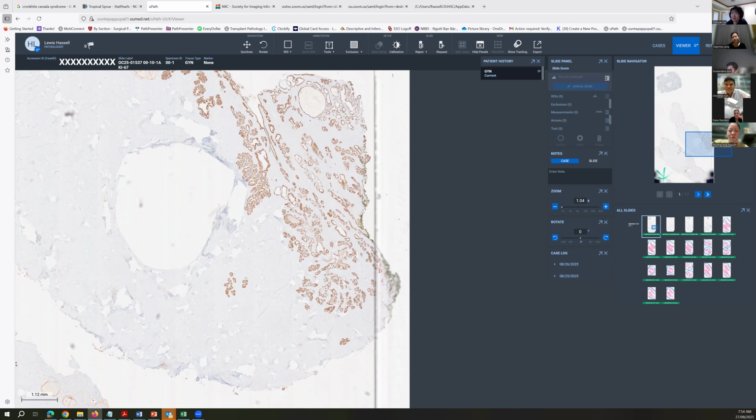I first wondered if this was all in situ disease because you have such deep penetrating normal glands in many of these areas. So your clinicians are okay with just giving the extent of the disease, without saying definite in situ versus invasive? Well, obviously they like it more; it's more comforting to them if we tell them it's invasive disease. But they understand the difficulty.